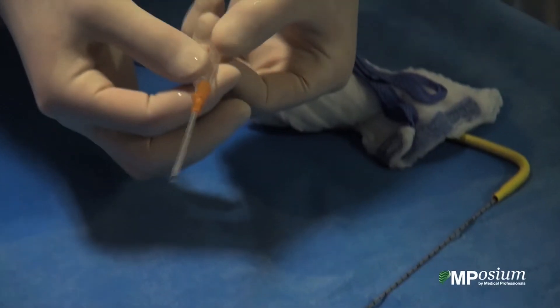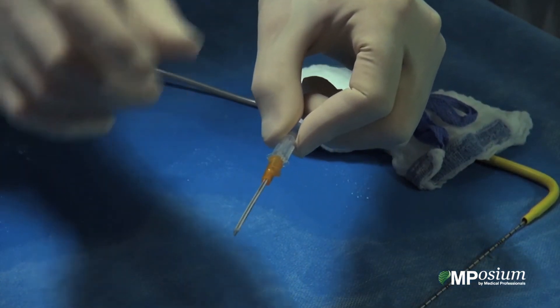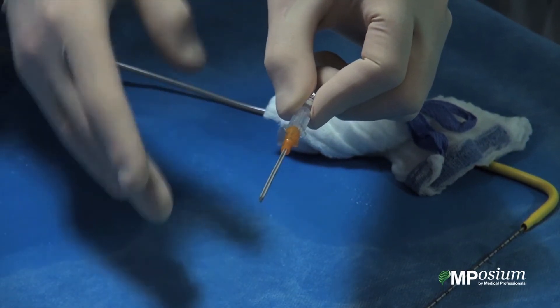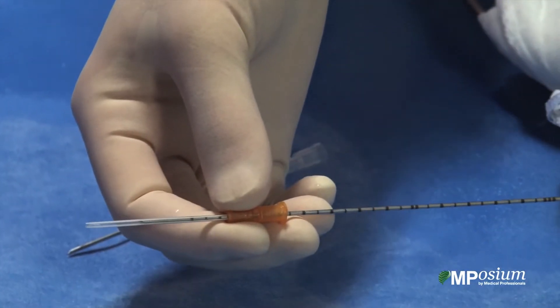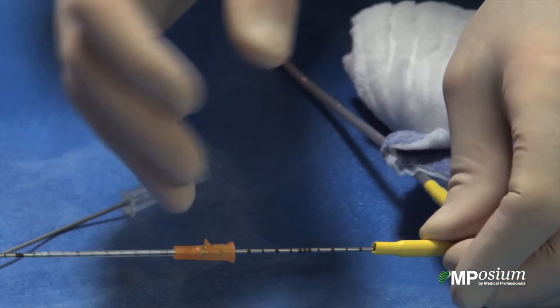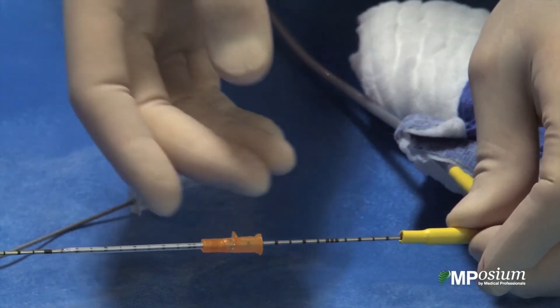I will use this angiocath, which is a large gauge angiocath. I will stick it in the patient for the first few centimetres — it will give me the rough direction to the target — and then I will be able to make the first few centimetres of progression of my cryoprobes, blindly, and then there will be enough space in the gantry to work with the cryoprobe.